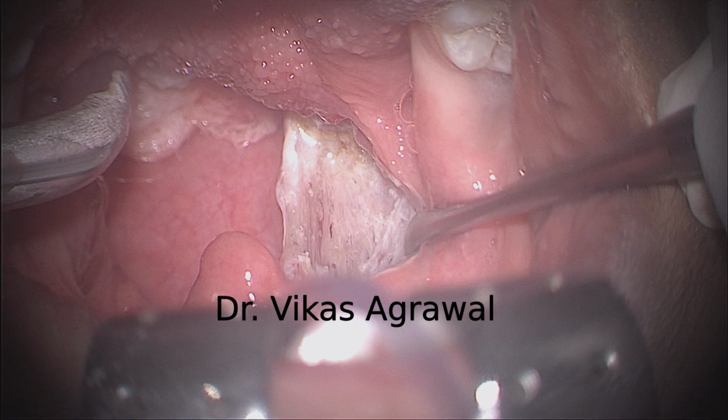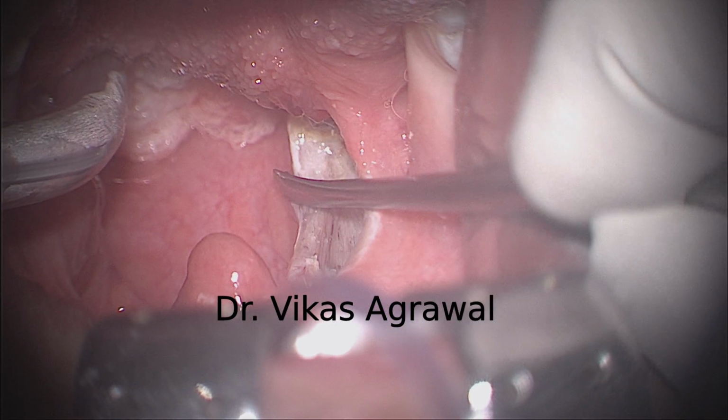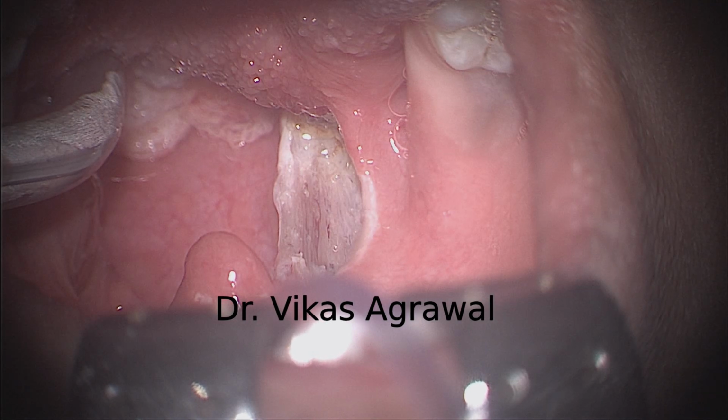So this is extracapsular tonsillectomy in a 9-year-old child. And you can see this is a hybrid tonsillectomy. The lower part is intracapsular. You can see a little bit of lymphoid tissue, just half a millimeter, as a cushion for bleeding at the lower end.